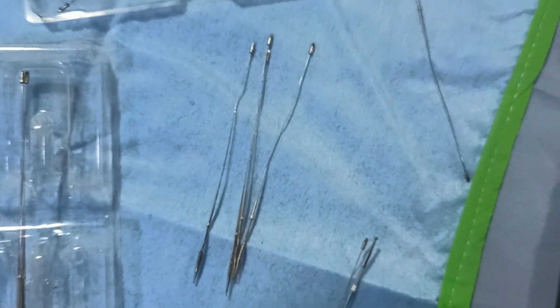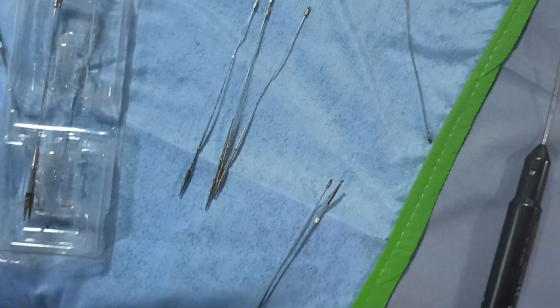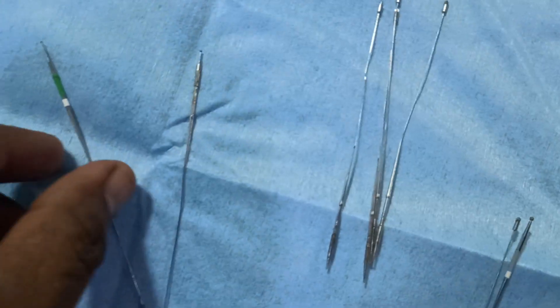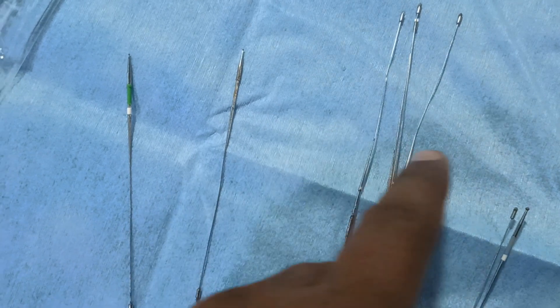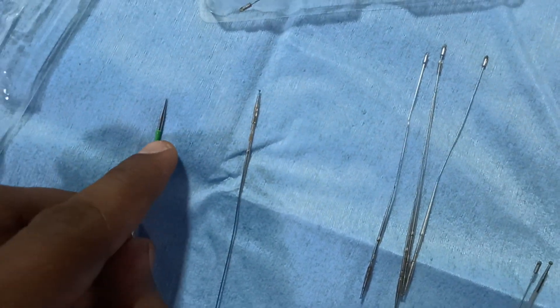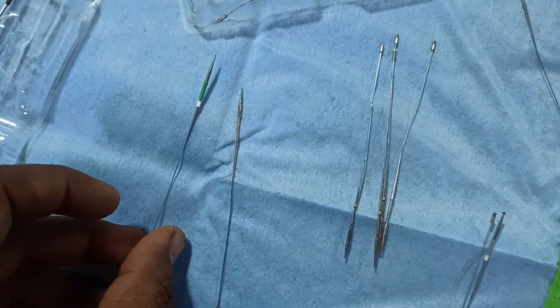When you reuse damaged burrs, they will definitely break during surgery and create an impact in the motor, making it unable to continue the surgery. Here you can see a few burrs that are damaged. This one is partially damaged. In some cases the sleeve may have come out — in those cases, don't reuse the burr.